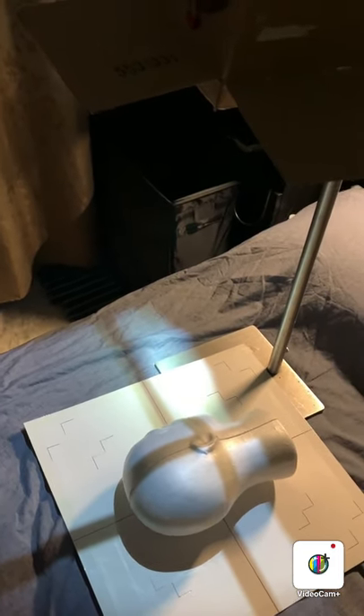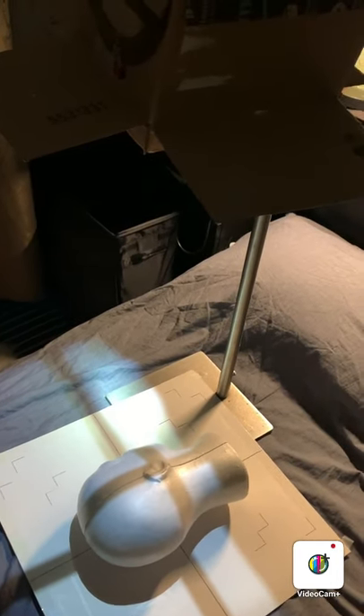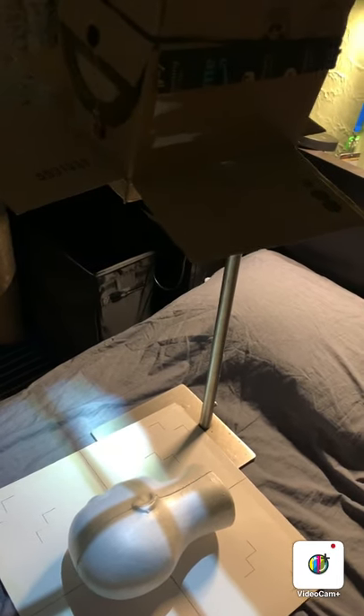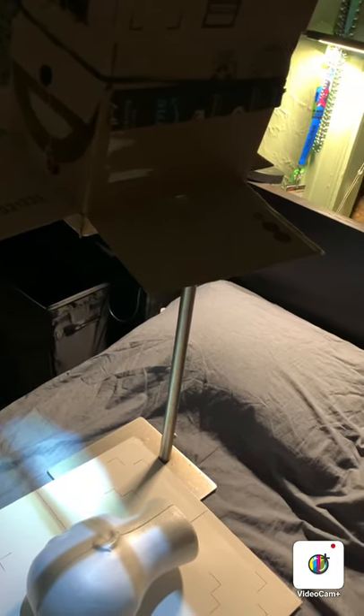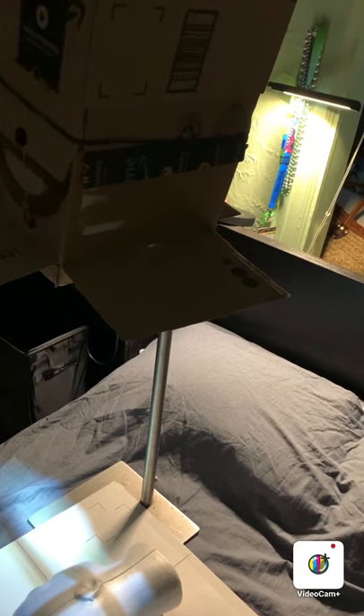I do understand that not everyone will have a vertical pole to hold their x-ray tube. But this is the best way I came up with to solve some of the deficiencies I noted in the original Rock the Registry YouTube. Any questions? You know how to reach me. Thanks and good luck guys.